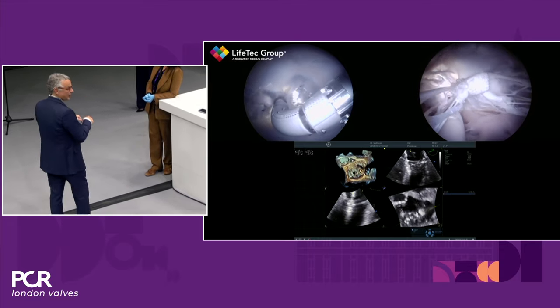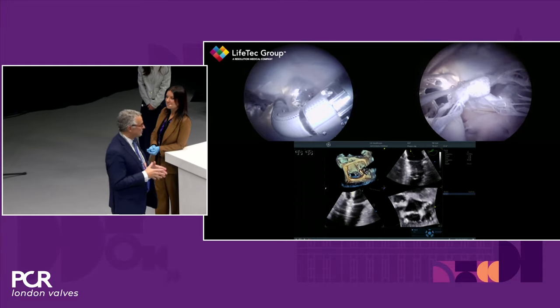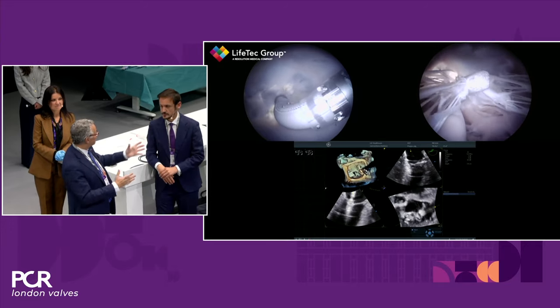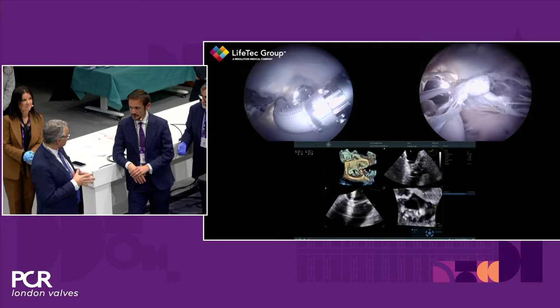But also, in these cases, it could be very important to select the right device. So, for instance, Maurizio, in such a case that we have seen before, an ischemic MR with a lesion, would you target A2P2 first? I would definitely target A2P2 first.